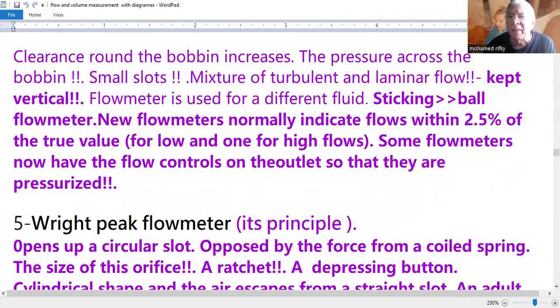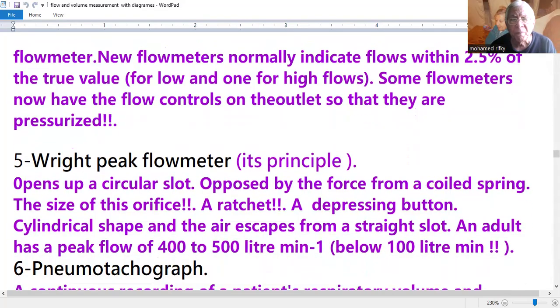You ought to tell them that these inclined tubes are coated with special material that minimizes static electricity and also the sticking. Of course, why do we have low flow and high flow meters? Suppose, to minimize the defects or the mistakes regarding the values.